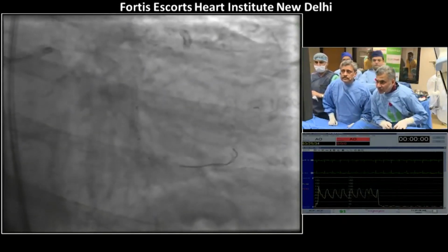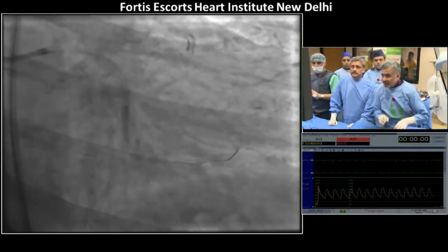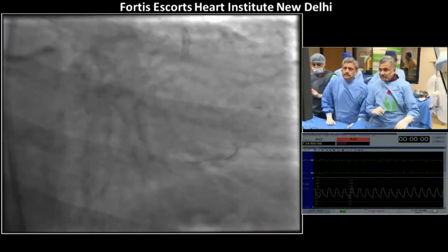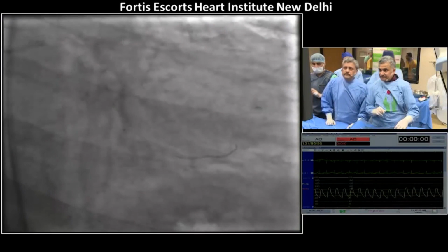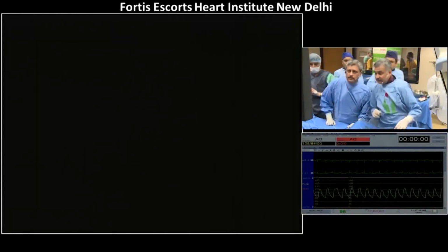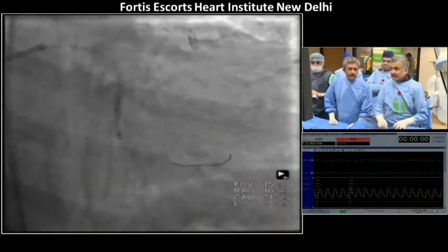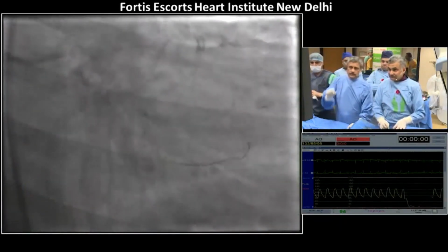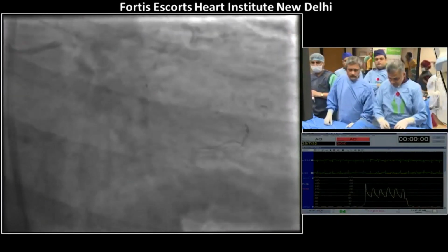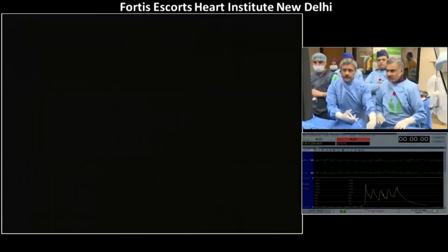Yeah, go up please. 1, 2, 3, 4, 5, 6, 7, 8, 9, 10, 11, 12, 13, 14, 15, 16, 17, 18. Here we are within the old stent. Let's see how much it is opened. That distal part hasn't opened. Deflate. So maybe a 2.25 at a higher pressure, because this is a smaller artery. Well, let's take a picture. Yeah, all right.